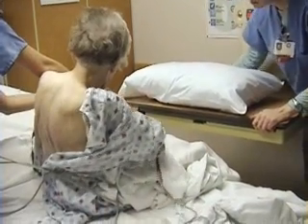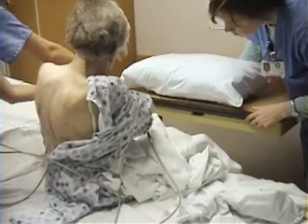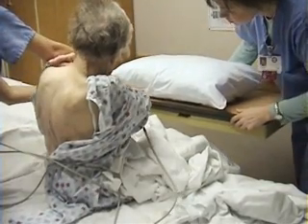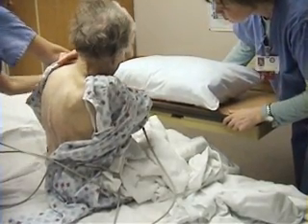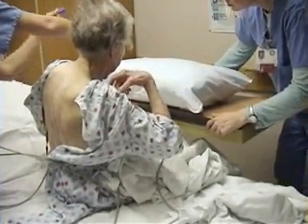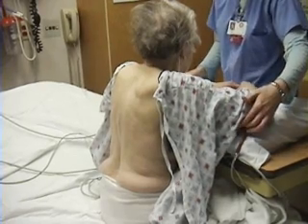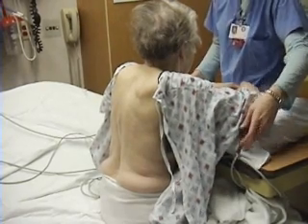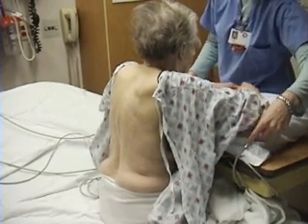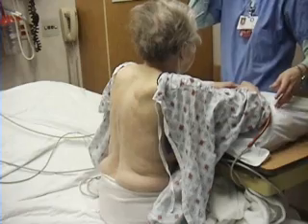You will need an assistant to help position and monitor the patient and assist with the collection of pleural fluid. Place the patient in a sitting position on the edge of the bed, with his or her arms resting on a table.